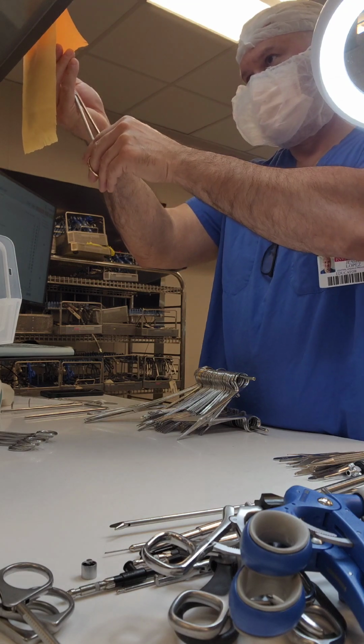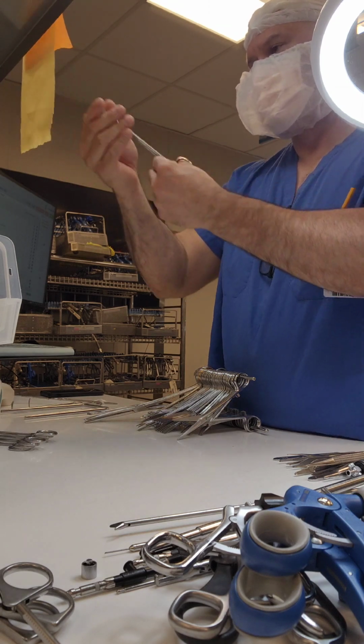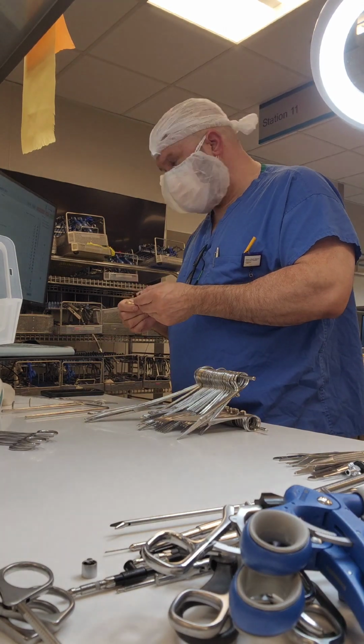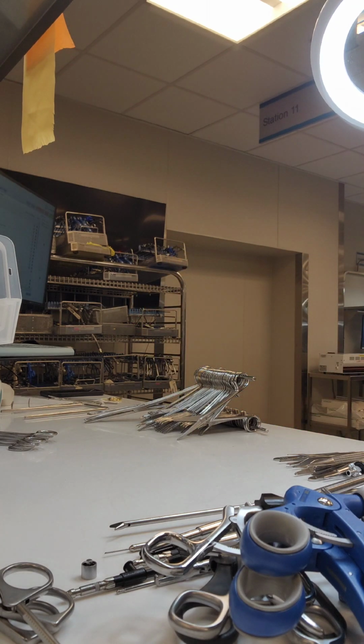So I'm checking this scissor here, and something didn't seem right to me. So I went ahead and I palmed it, and it's snagging on the very corner. So now I'm looking at the scissor. I know it's a Metzenbaum, but I want to place the right item number in there. I'm making sure I'm going to get the right item number. I place that scissor off to the side, and now I'm looking for the scissor, right? And here's the other part of it.